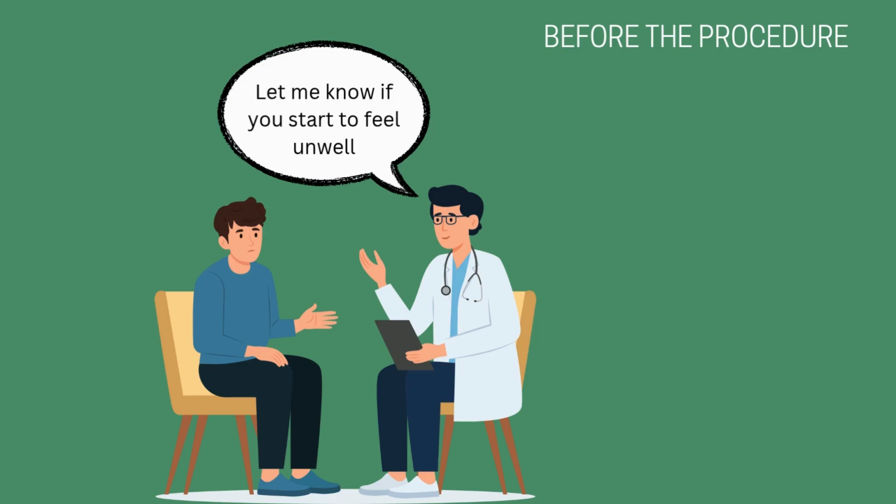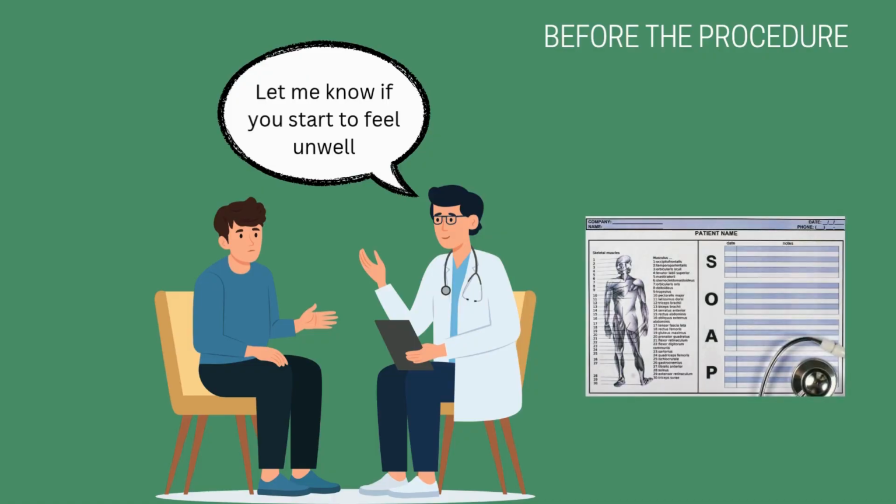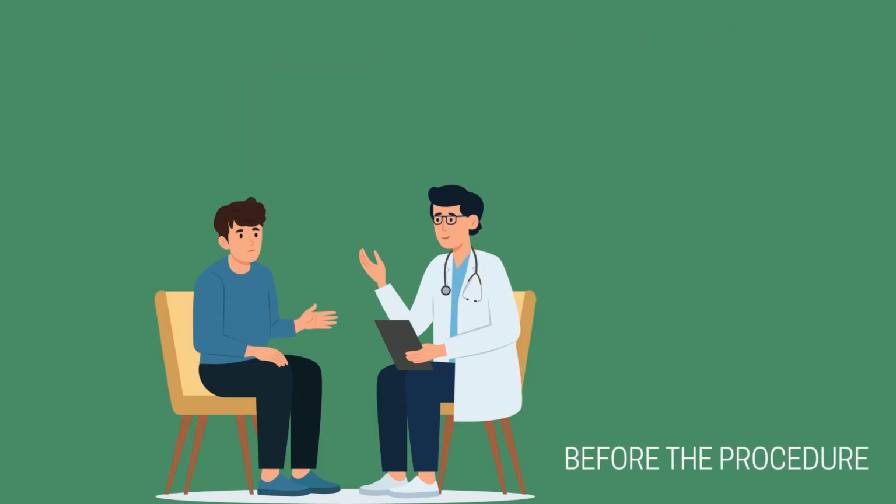Those little moments of control go a long way in helping a patient feel safe. Finally, document or pass along anything important, like a fainting history, or if they prefer a certain position for the draw. Starting the phlebotomy visit correctly is the key to a smooth procedure for you and for your patient.